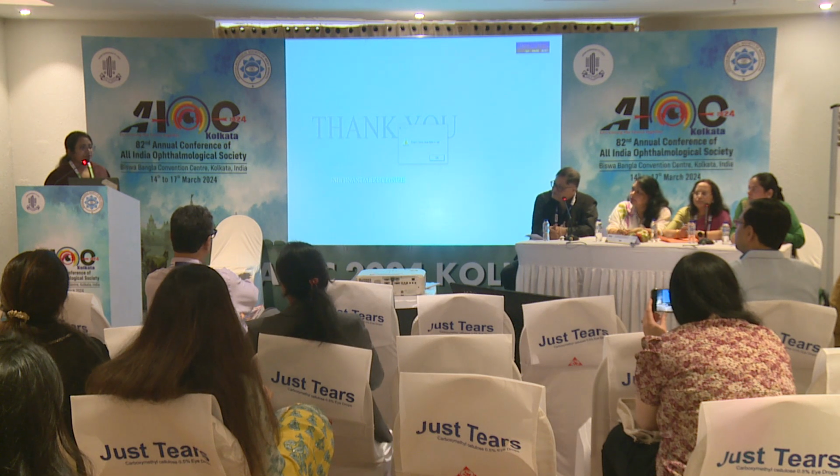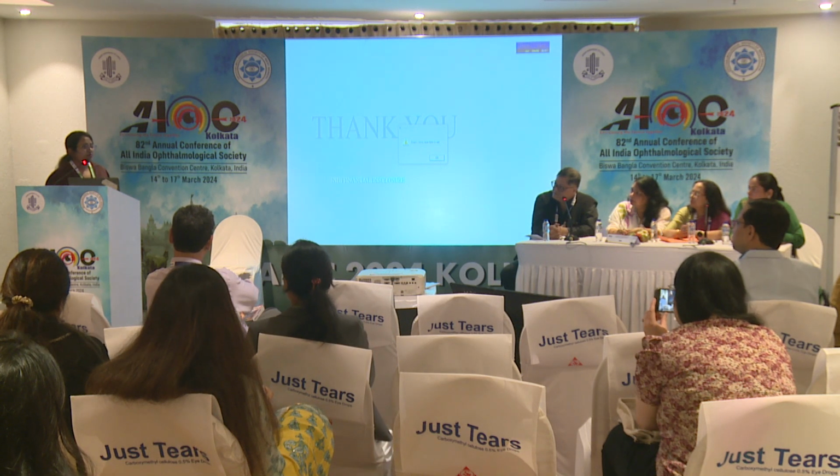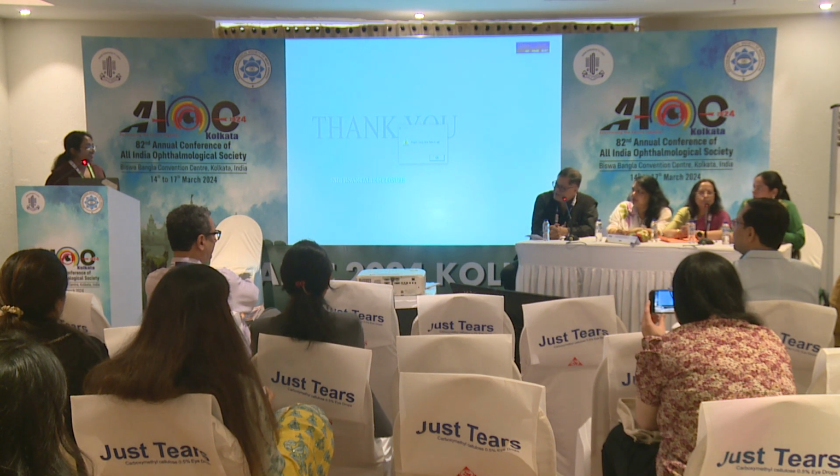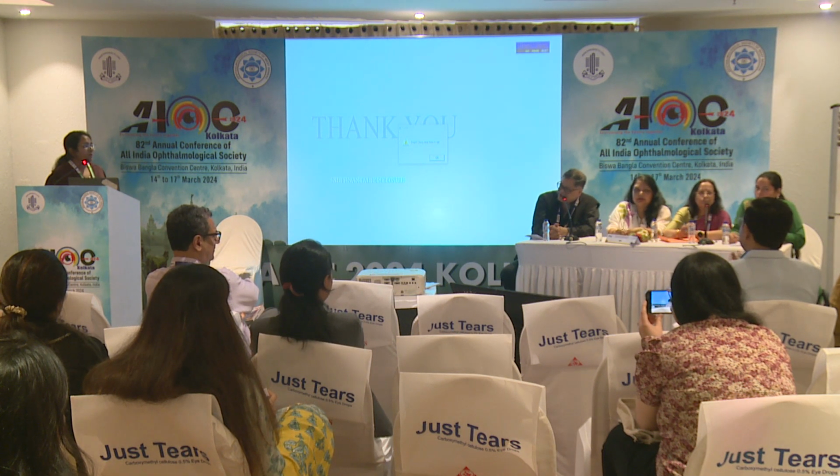Sir, in our setup, we have a peristaltic AMO compact phaco machine, sir. Yeah. That's a good phaco machine.